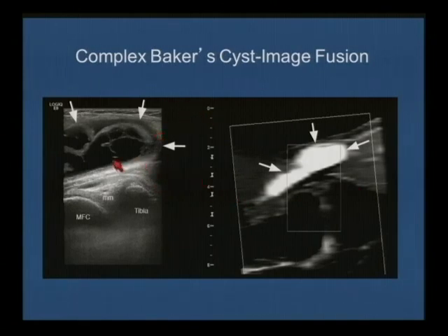which actually I'm talking on tomorrow. I'm talking on fusion of ultrasound with CT and MR data. But here's one that we did, a case where there's fusion with MR. Here's a Baker's cyst with septation, slightly complex, long axis view corresponding MR in exactly the same plane and same position.